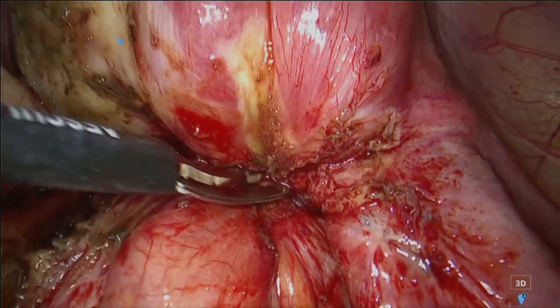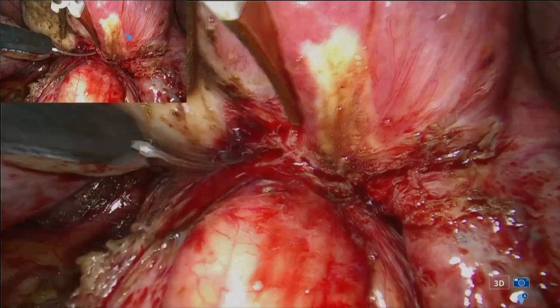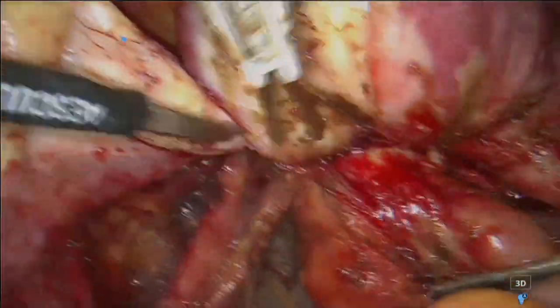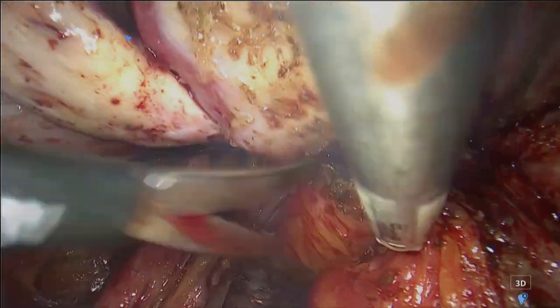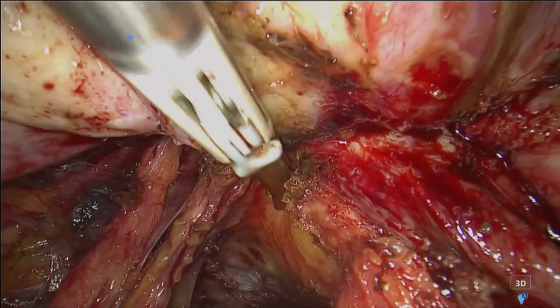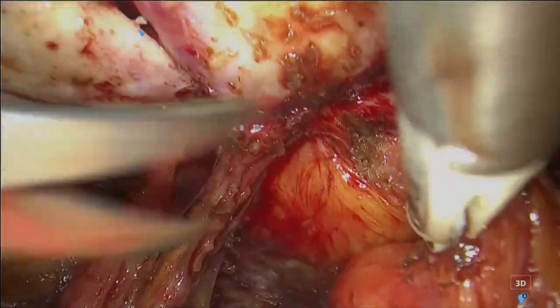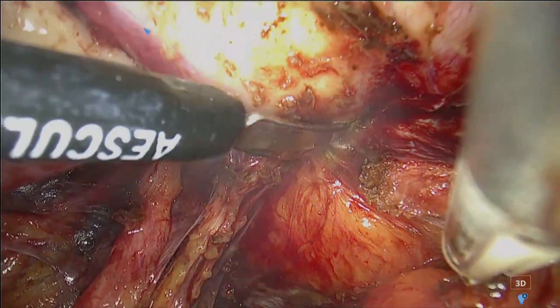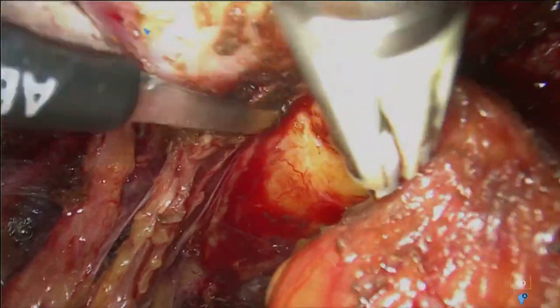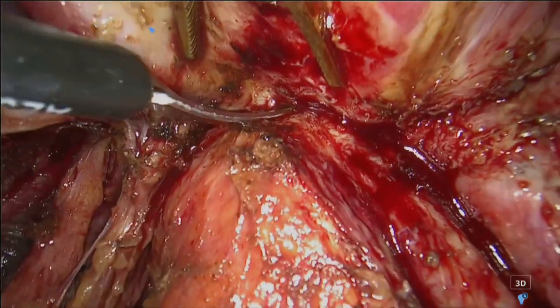For the moment it's better to start to free the bowel nodule here in the middle from the posterior wall of the adenomyotic nodule here. Okay, and here we start to arrive. Sometimes the use of precise monopolar current connected to the scissor in the left hand can help us to work like this and to open this area. Okay, again, we go inside the nodule.